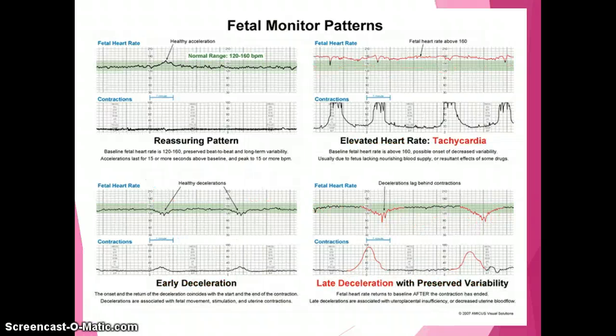Looking at a reassuring pattern, the fetal heart rate falls within the normal range and has a nice acceleration. An acceleration is an increase of 15 beats per minute for at least 15 seconds above the baseline. For example, if the baseline is 130 and the heart rate accelerates to 160, it then returns to baseline. When assessing reassuring patterns and variability, we want to see accelerations lasting 15 beats for 15 seconds or more compared to the baseline.